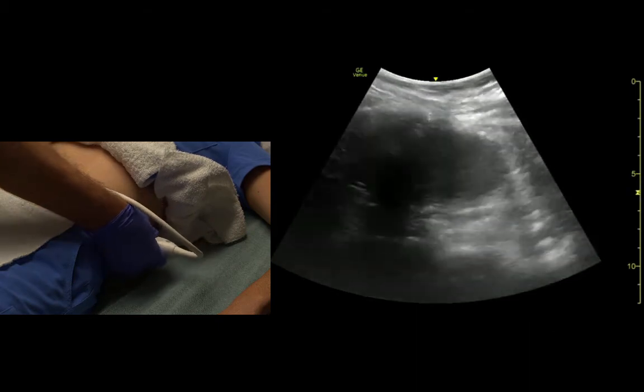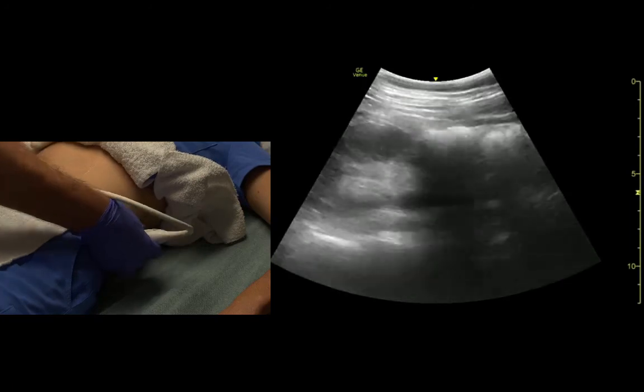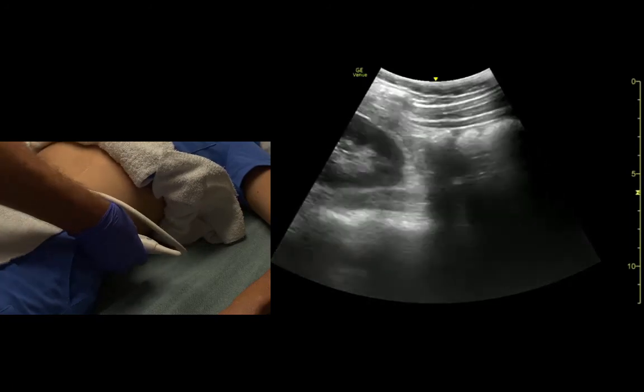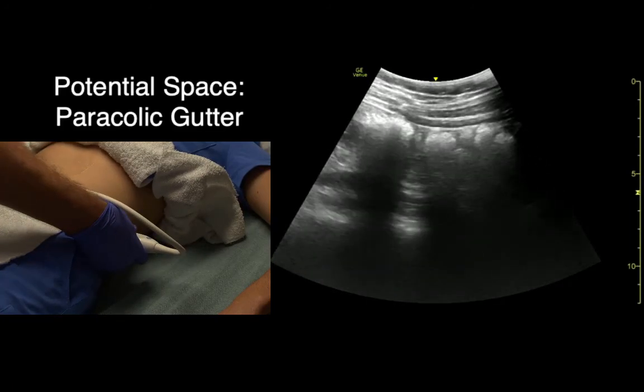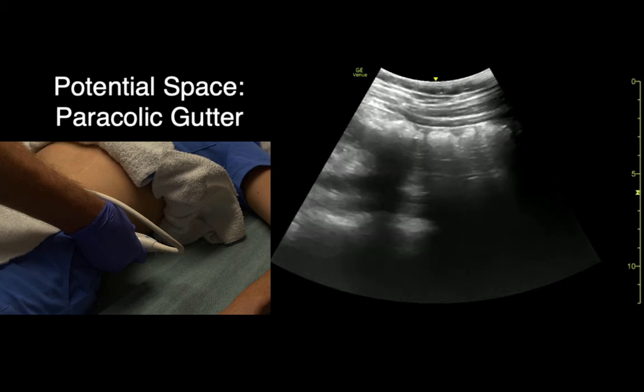If we fan below the kidney, we see these bowel gas bubbles. That's the pericolic gutter.